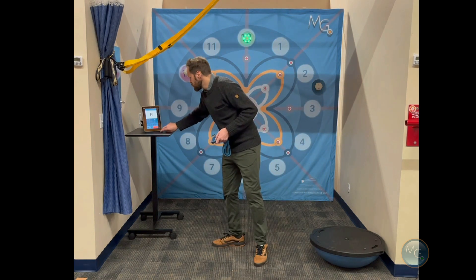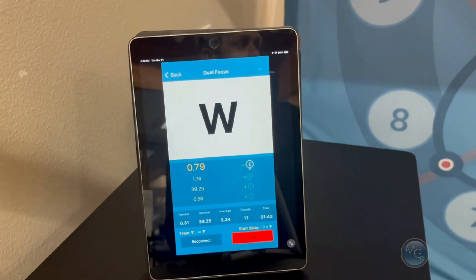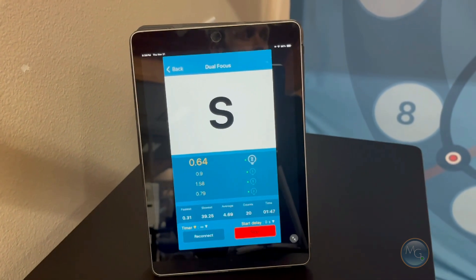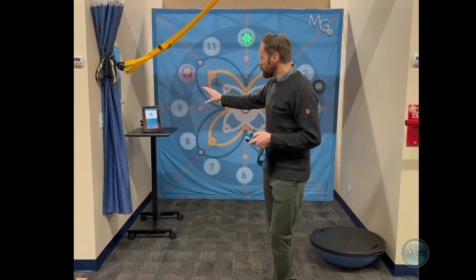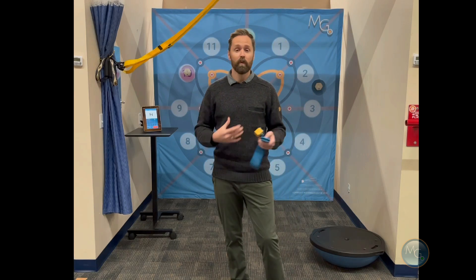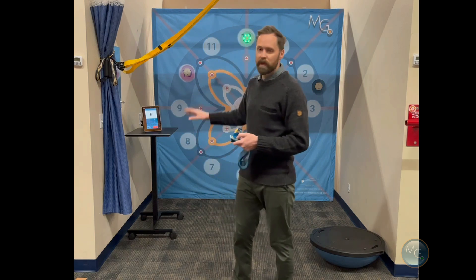So we're going to press start and what you'll see is multiple letters appearing on the screen. You're going to instruct your client to call out those letters as they come up while also interacting with the targets as they light up. You can also move this screen around — so if they have a peripheral vision issue to one side, or for whatever reason you want them more focused to the left or right, up or down, you can put the screen in different places.